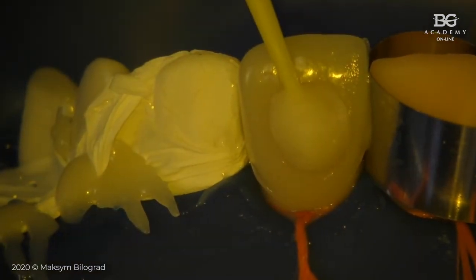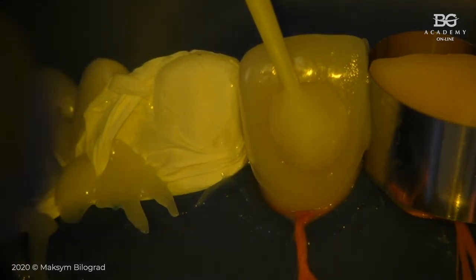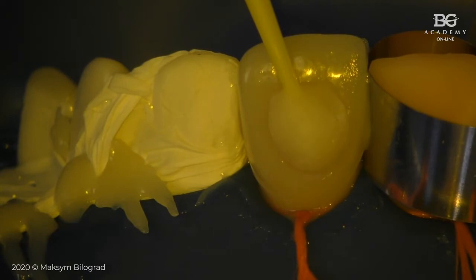Another thing, just take a look here. I'm not pressing, okay? Now look, if I press, what happens? I will magnify to show you these details, because they are small details but they are really important. Just take a look. See, I press, one more, again. See, it's a small movement, but it is. And imagine if you just pre-cure your resin cement, but your veneer has already moved from the initial position, you'll have a really thick layer of resin cement underneath your veneer, which is not good because it's softer than ceramic, and you may even get cracks here.